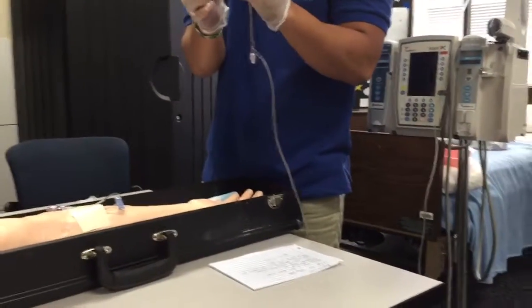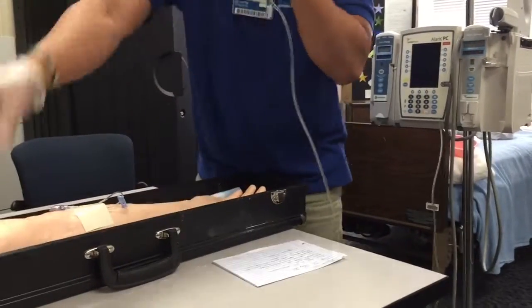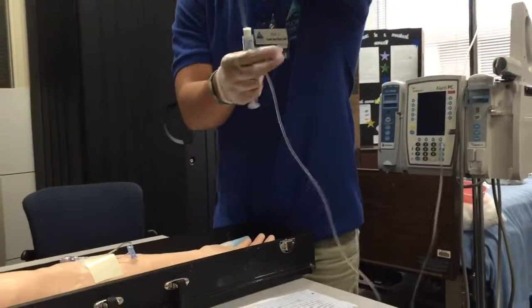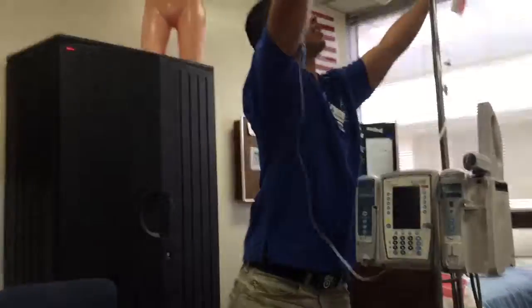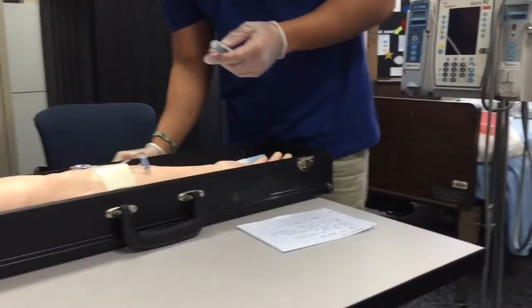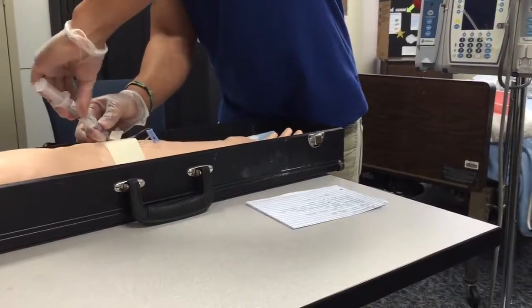And so now I'm going to perform my ASASH. So first, let me put this back on. First, I would use the ASASH method. So I would aspirate first after I cleanse the site with alcohol, which I already did. I'm going to go ahead and connect this, which is normal saline.